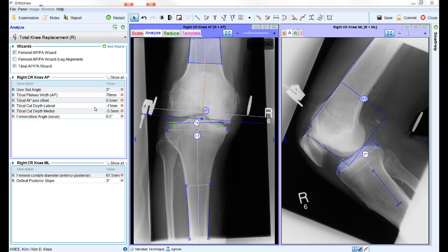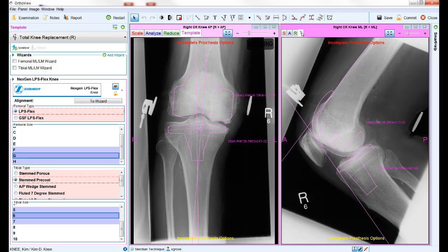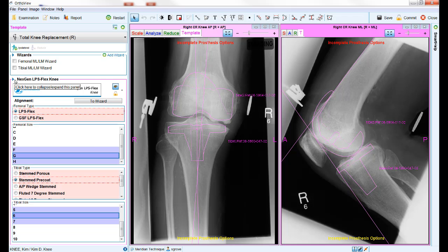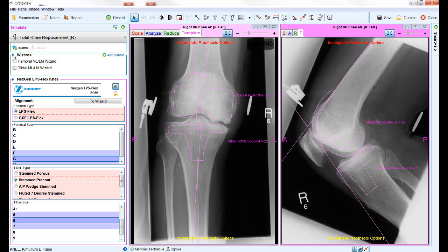Once you are happy with the positions of the wizards, you can then move on to the templating stage by clicking the template or T tab at the top of each image. Here the software will make use of the reference points and measurements taken with the planning wizards to do some initial positioning of the implants and highlight some suggested sizing. Your template choices with all the appropriate sizes and options appear on the left hand side of the screen. If you are using a small or low resolution monitor, the blue triangles on the corners of each section allow you to minimize and maximize individual portions.